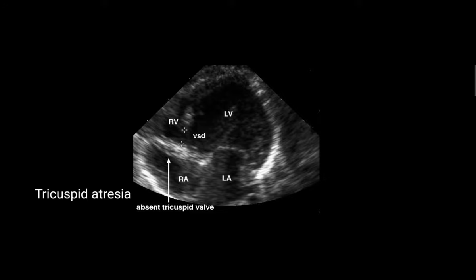The next image is an echocardiographic image of tricuspid atresia. Here we can see there is no valve between the right atria and the right ventricle — it is like a wall with no opening through which blood can travel from the right atria to the right ventricle. So this is an image of tricuspid atresia.